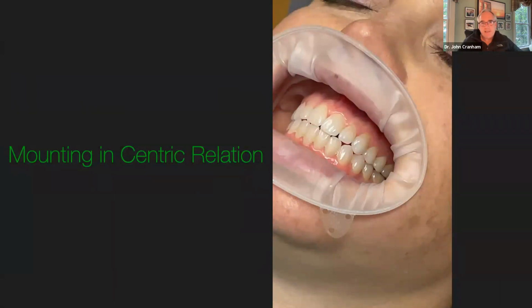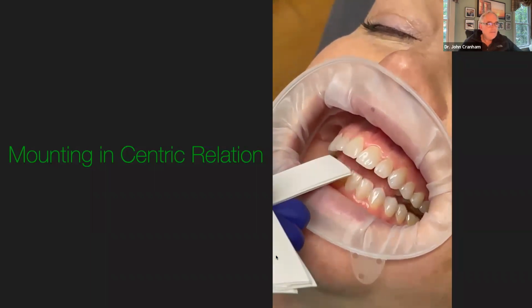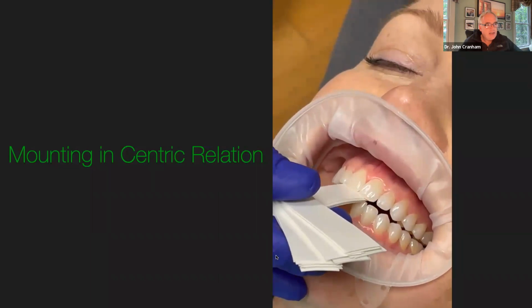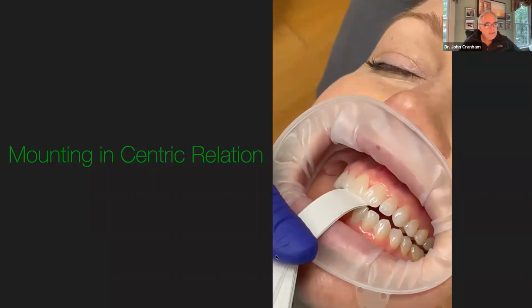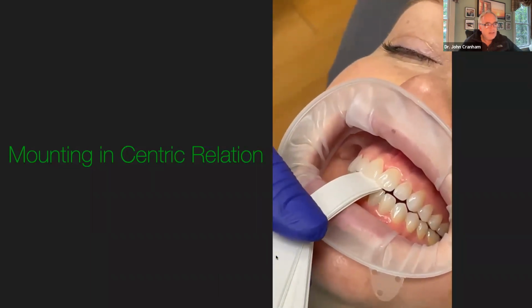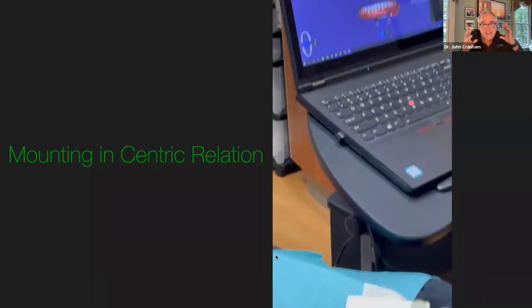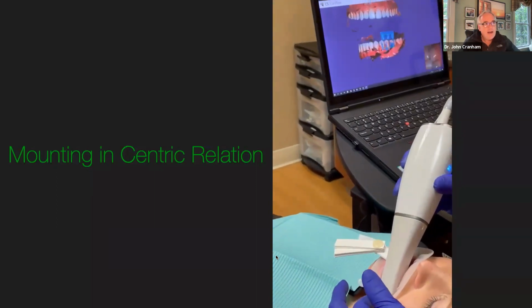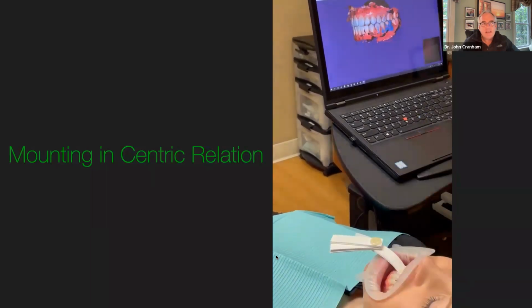Now, a couple ways to do your scan, and I'm not going to go through all of them in this webinar, but a very simple, classic way is to use a Lucia jig, a leaf gauge. With a leaf gauge, we can just slide forward, back, and squeeze. Squeezing is a good way to load test. And once we are sure that it does a good job of holding them where they are, then we can just scan the space between the teeth on either side. That captures very, very rapidly the position of the mandible against the maxilla in CR.